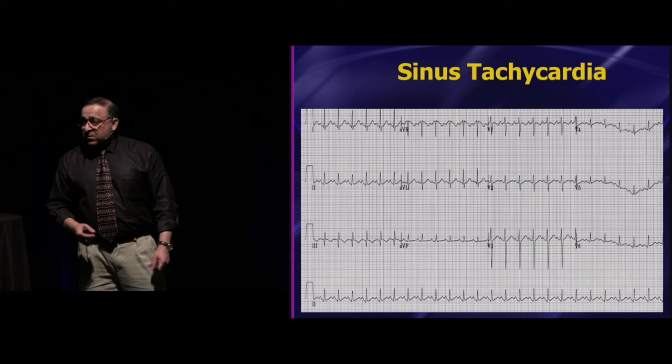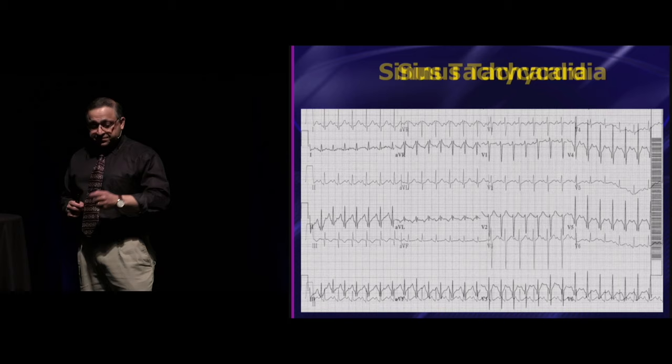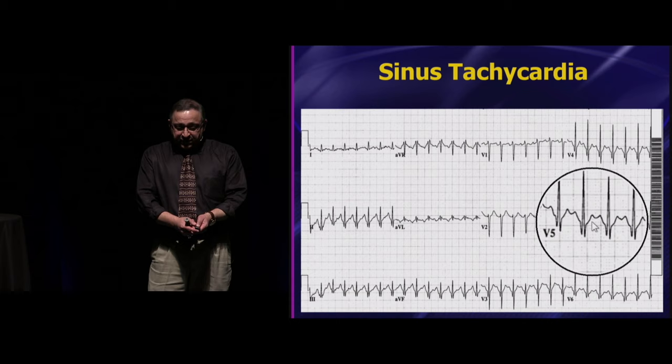Again, that's another point that I'm going to reemphasize a little bit later on. Camel hump T waves, worry about a P wave buried in there. Here's another example of sinus tach, and another nice example. See those camel humps? That's your T wave there, and then your P wave, T wave, and then your P wave, and so on.